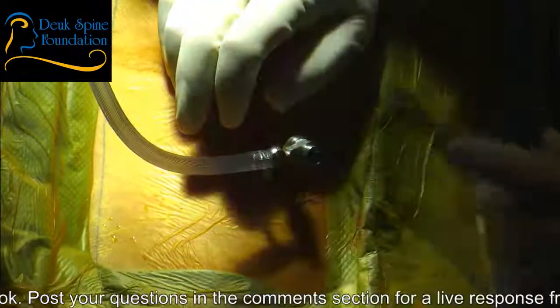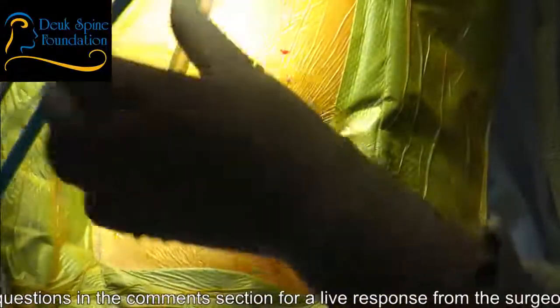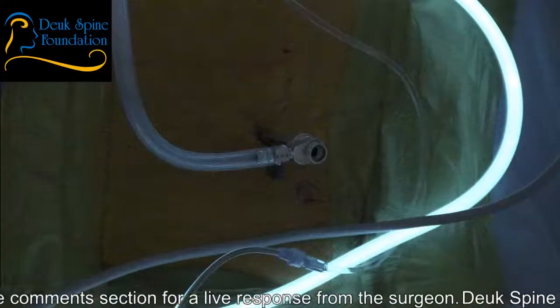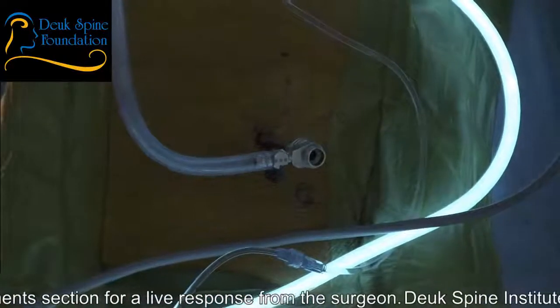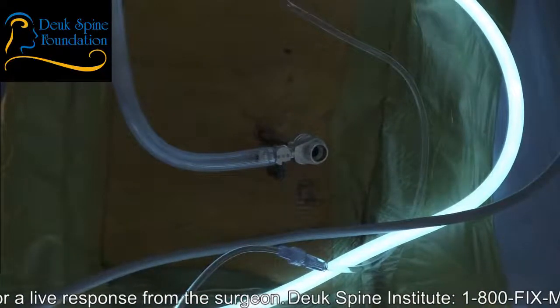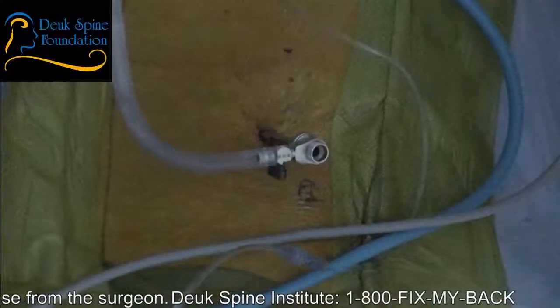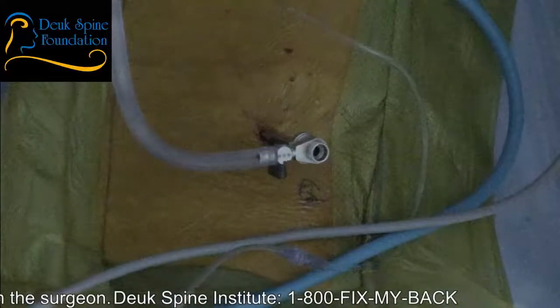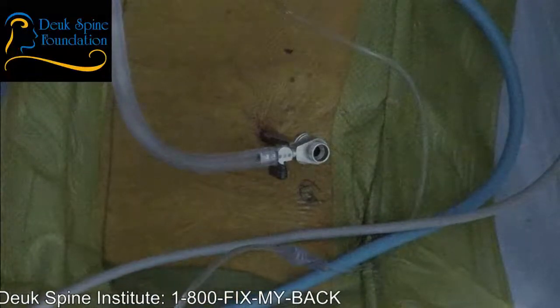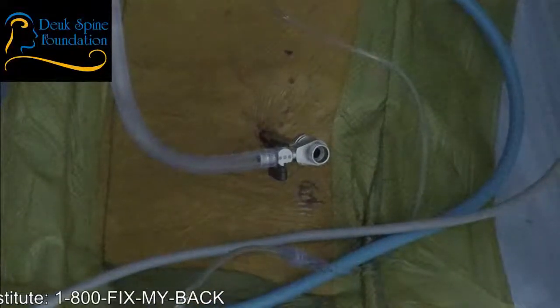Come on, let's not do that. What is that? Great. Let's just not do it. What happened to cause that noise? Right, so how can you avoid that? Well, if the cap was all the way on, would it snap? If the cap's on all the way, will it snap? Correct. So if you start with it on all the way, it won't do that.